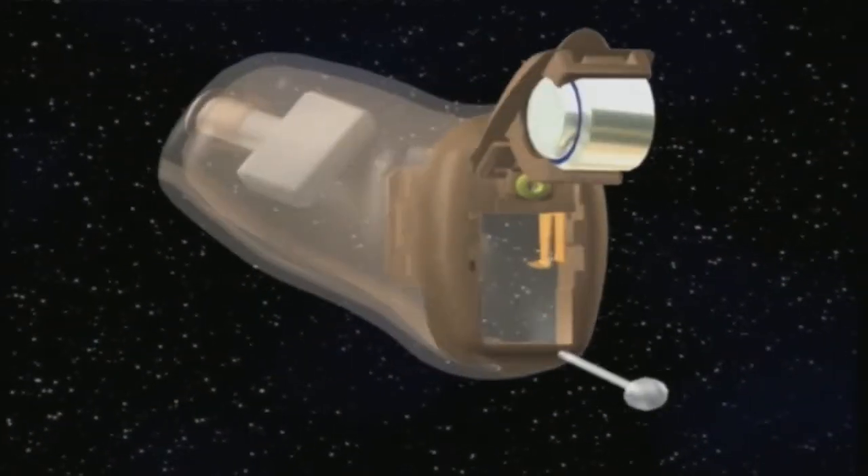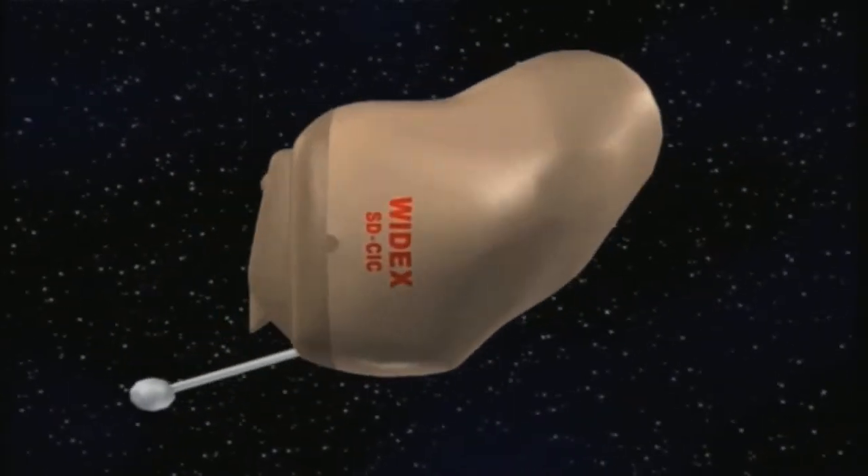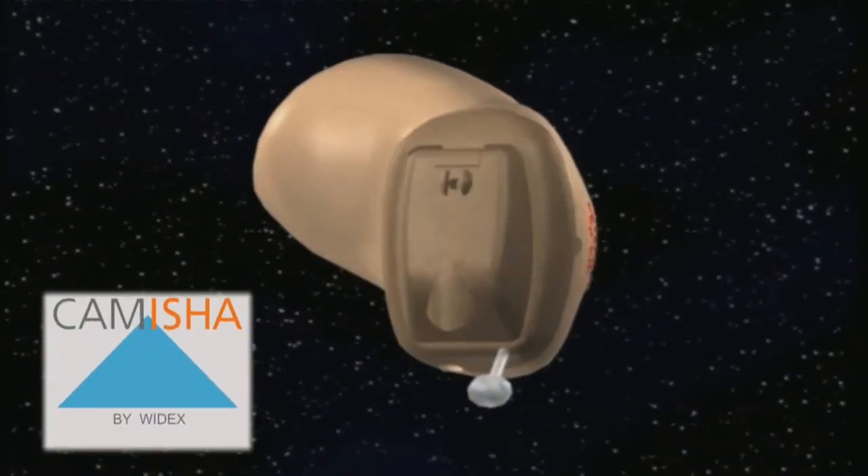CAMISHA offers the hearing aid user optimum fit, greater comfort, higher shell quality, and greater durability.